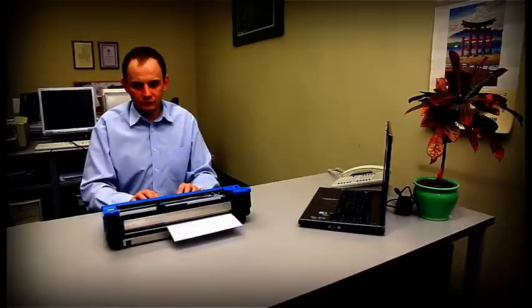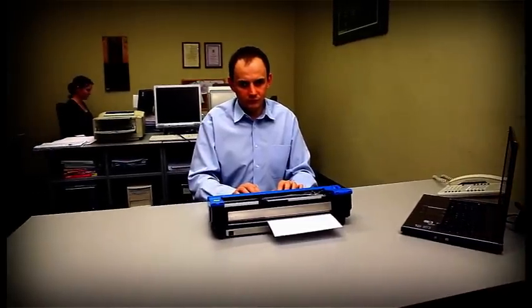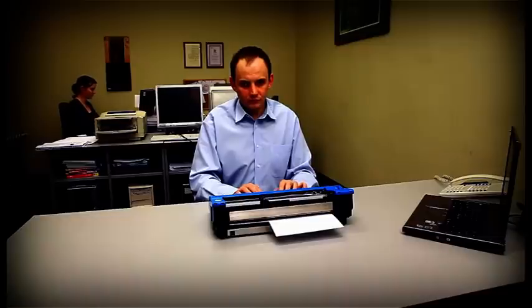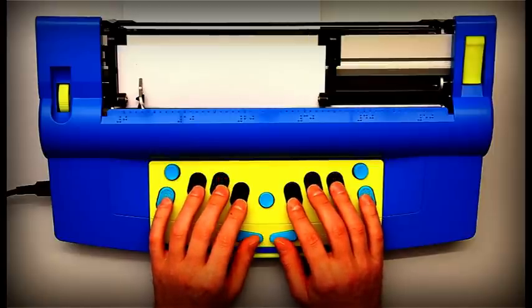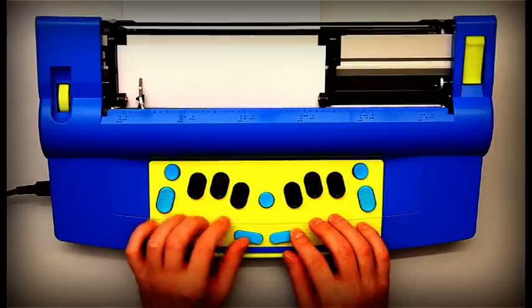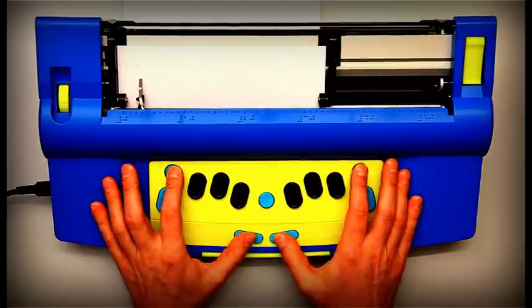When you first receive your Mountbatten, the command key is inactive. It's very easy to activate and deactivate it. You switch the command key from inactive to active and from active to inactive using tab, back tab, new line, and space.